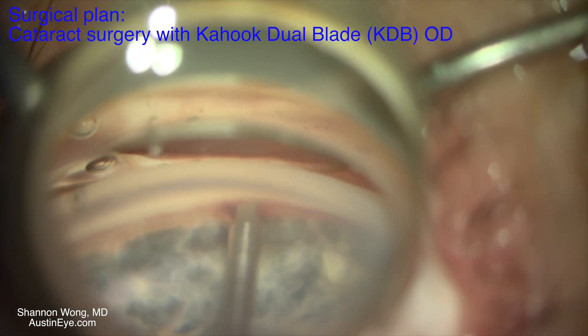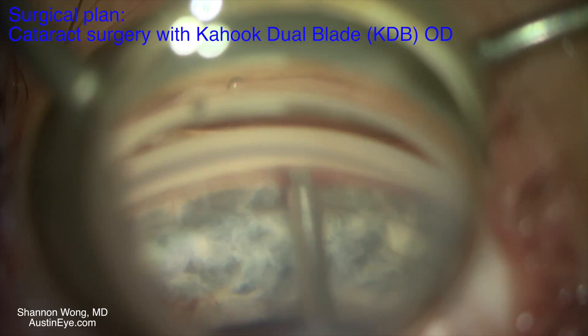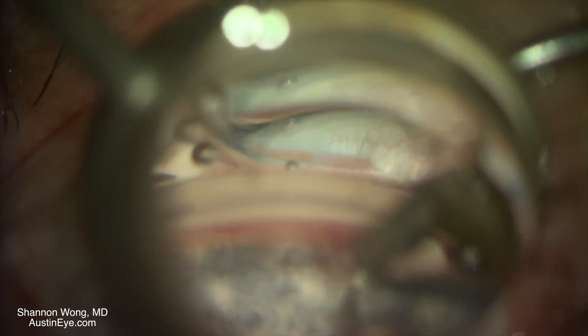We use the Kahook dual blade by placing it into the pigmented trabecular meshwork and sliding it one direction, then rotating the Kahook dual blade 180 degrees and sliding it in the opposite direction.